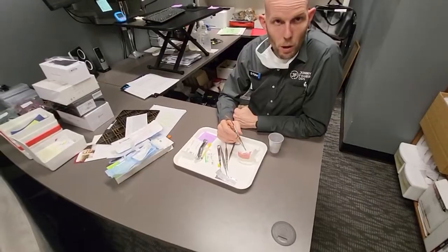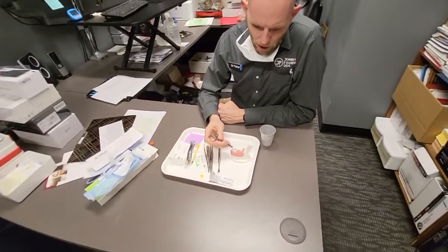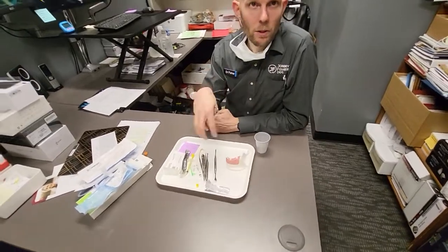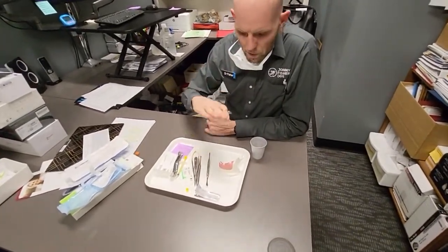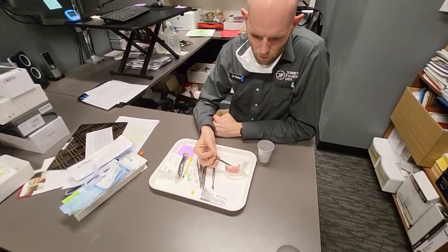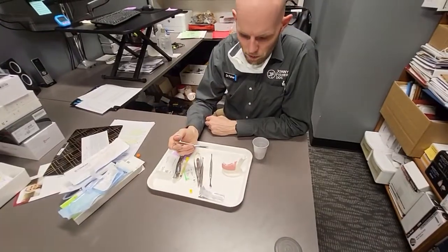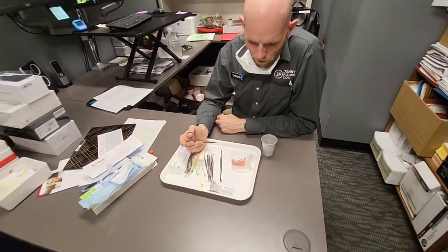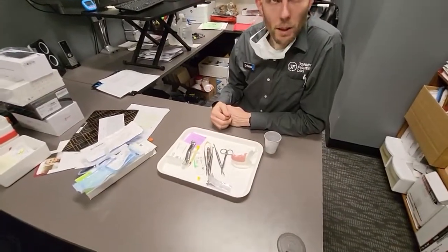These come out anywhere from ten days to three weeks — I usually target about two weeks to take them out. When the patient comes back, the sutures will be super loose and the collagen membrane will be half dissolved. You'll get bone particles coming out — that's all normal. But the base, the majority of what's underneath, will remain intact, especially if you had good bleeding that creates that initial blood clot. Pretty straightforward — good luck.